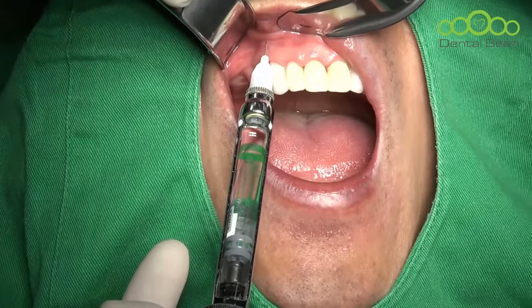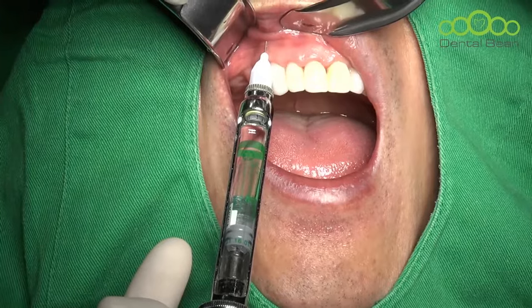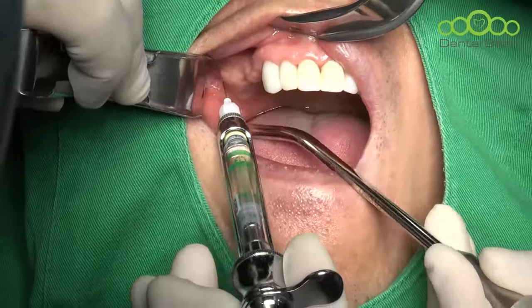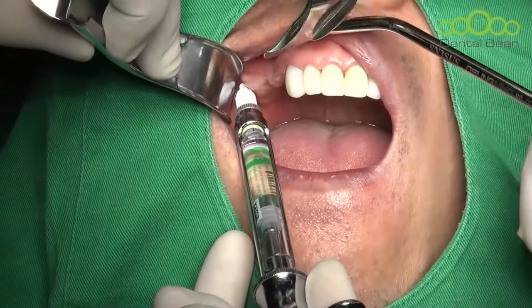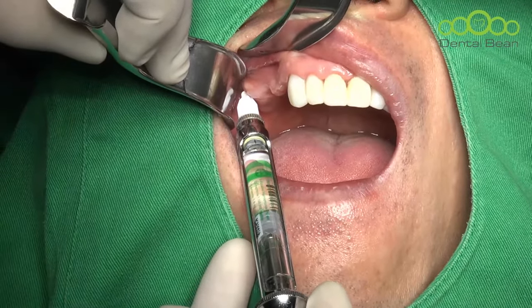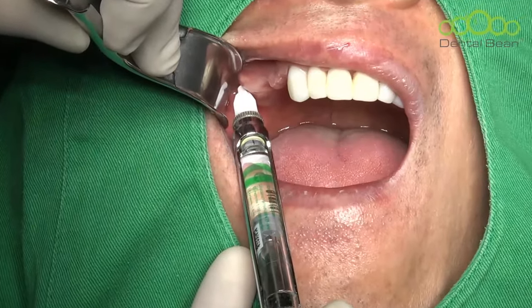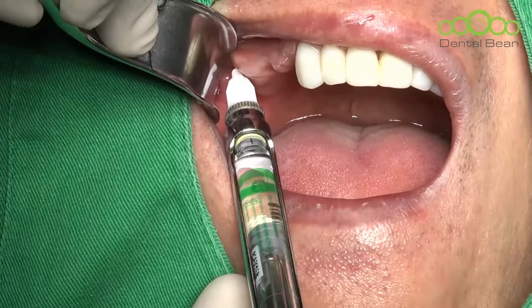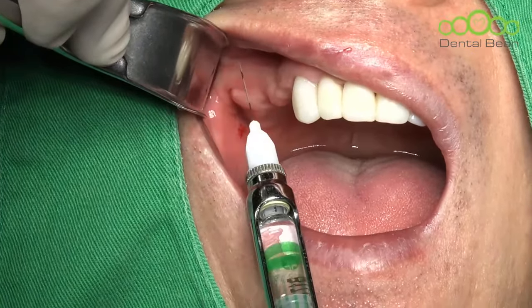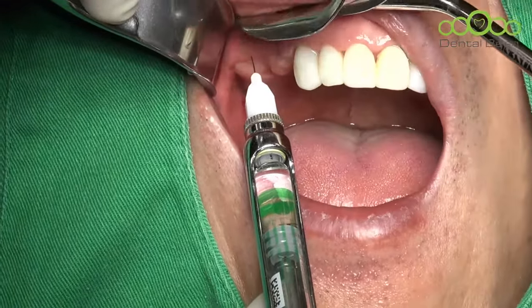I'll spend one third to block the anterior superior alveolar nerve, and then one third to block the posterior superior alveolar nerve. Better to inject very slowly. Then I'll spend the remaining here, the middle superior alveolar nerve.